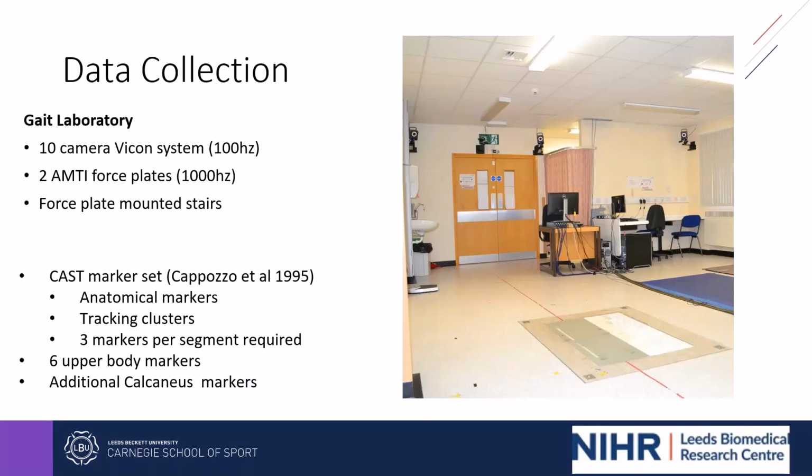So in terms of data collection, this is our laboratory at Chapel Allerton Hospital, which is in North Leeds in the United Kingdom. At the time, it has been updated since, but we had a 10-camera Vicon system and 2 AMTI force plates that were embedded into the ground, which you can see just in the ground on the image there. For the other activities of daily living, such as the stair climbing and the sit-to-stand, we did have some other equipment in situ.